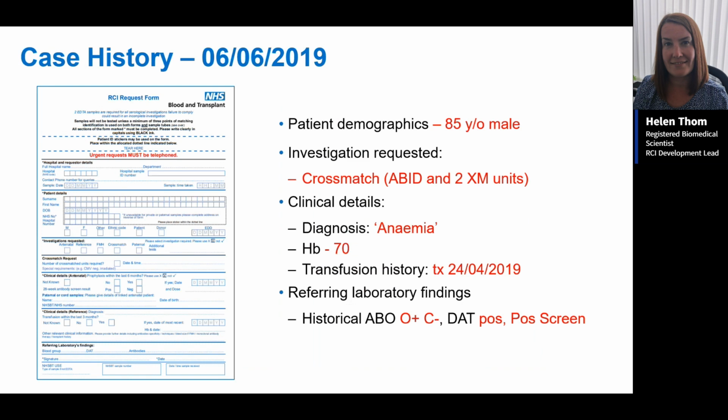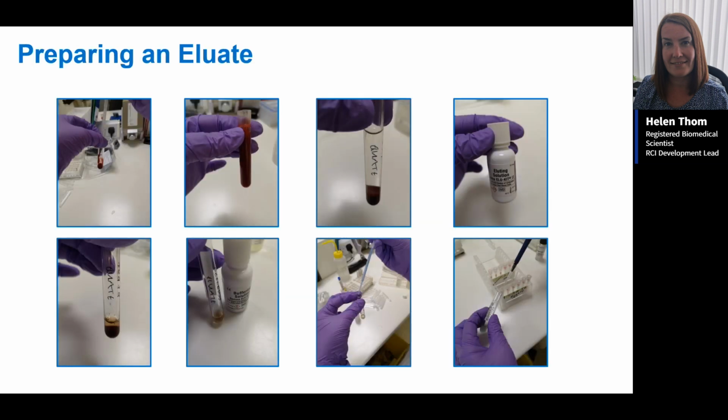So, that's gone on the next slide there. With the cards, the one that I was showing you there, there are different reagents impregnated into the card. So in the same way that you would have IgG impregnated in the card to see if there's any IgG bound to the red cells, you can do what's called an extended differential DAT. So you can look for IgM, or C3d, C3b, just to tell you what else is stuck to the patient's red cells. So instead of just IgG, you can look for IgM if you wanted to. I hope that makes sense.